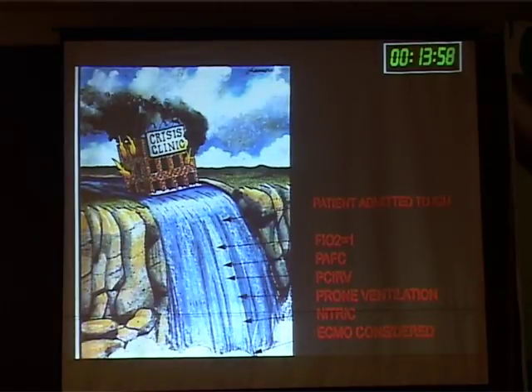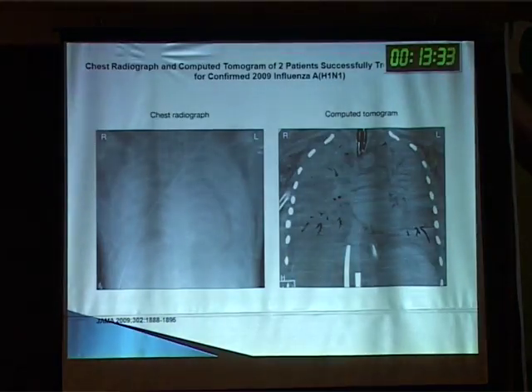The patients I am talking about are classical patients admitted to the intensive care unit with 100% ventilation, FiO2, with a PEEP of more than 15, pressure controlled inverse ratio ventilation. You have already tried. If you have the facility of nitric oxide, you give nitric oxide, you turn the patient prone. Whatever is possible in our armamentarium, we have tried it, but it's not working. The patient has refractory hypoxemia or hypercapnia.